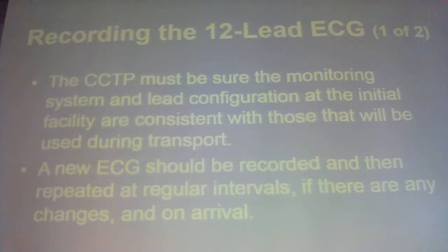The cool thing about our LifePak 15s is once you turn them on and do the first 12 lead, they automatically look at the ST segment every 30 seconds. If at 2.5 minutes there's been a significant change in that ST segment, it spits out another 12 lead for you. So that's called a what? Clue that something's changed. Right?